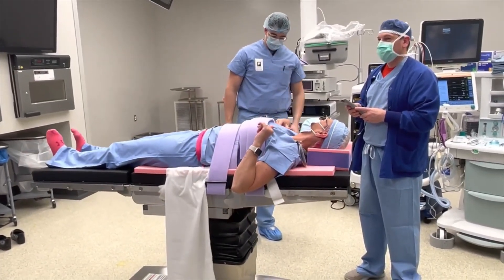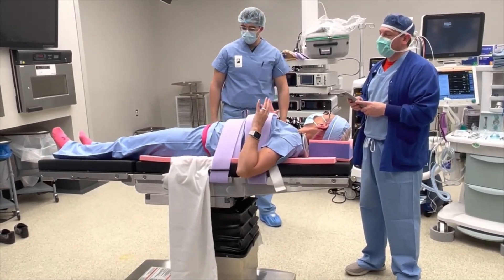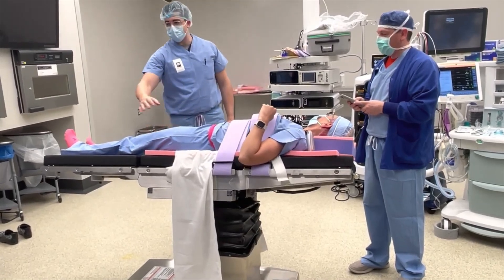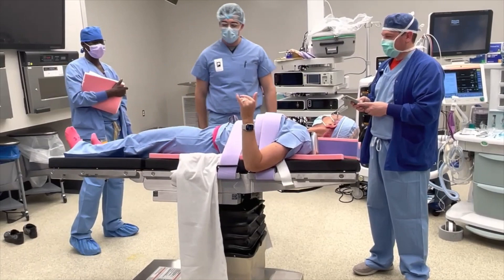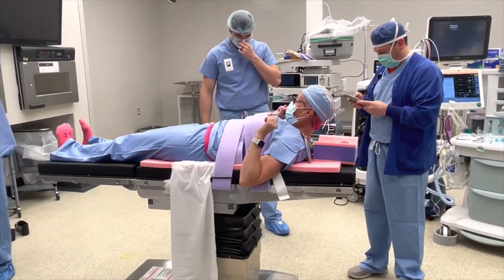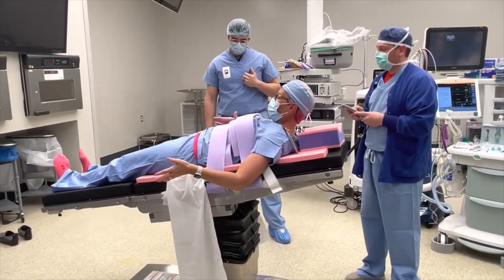I don't want you to tilt her today. It's just closed — I'm going to make it vertical. Is that a sneak attack? And then ideally we'd have a strap around that ankle. I didn't even slide there. I felt the weight of my body.